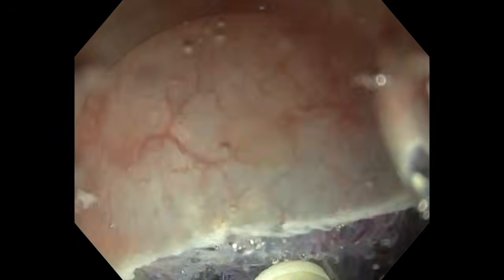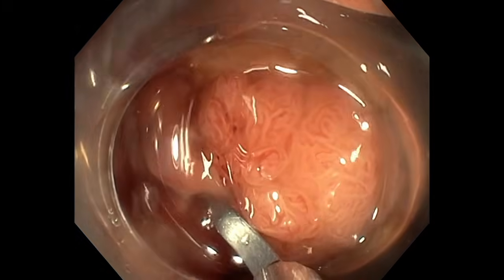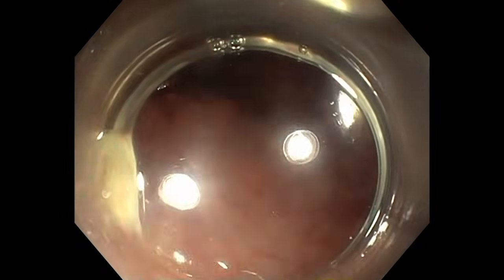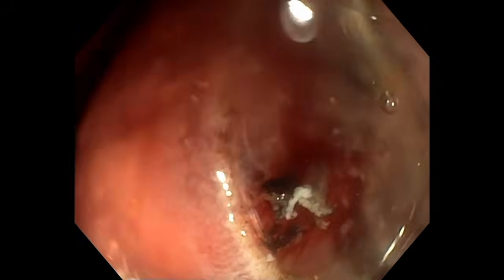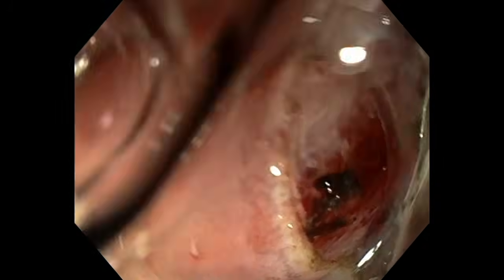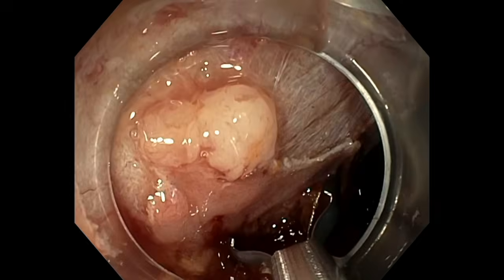So I do my trimming and my dissection on the oral edge after retroflexion. I put another traction on the oral edge on the 2 sides of the lesion. So once again, my goal is to remove the 4 edges from my field of view and to have more facility to enter into the submucosa.